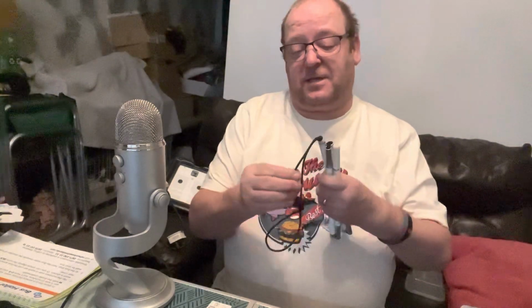I'm just showing you there are two different places that you can hold it. So you would walk with that across your chest. That's enough to tell anybody that you've got a visual impairment. And when you fold it up, that makes it easy to carry, because you don't need to take the cane with you everywhere you go. And the strap holds it together.